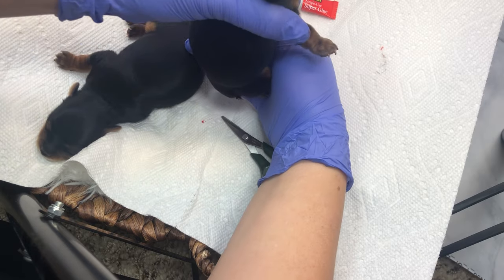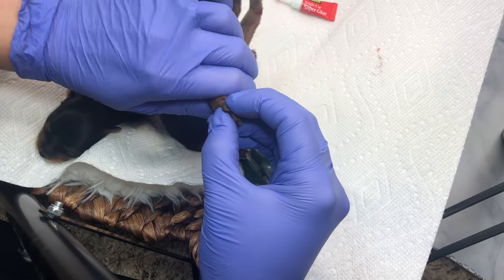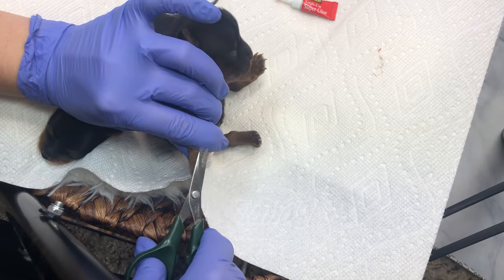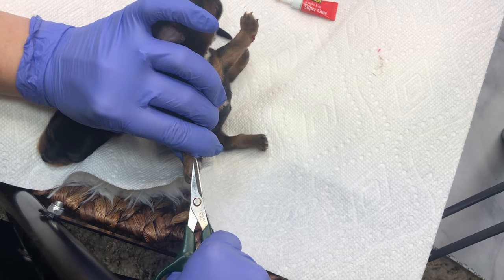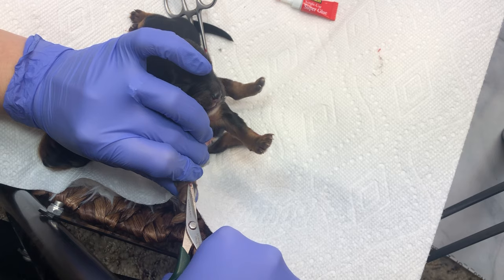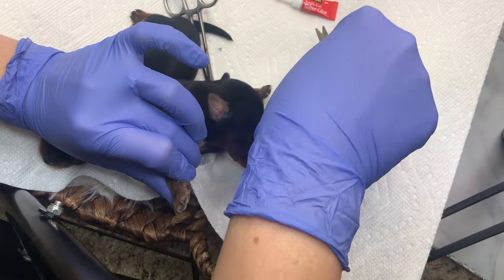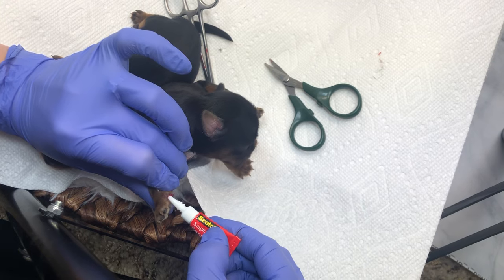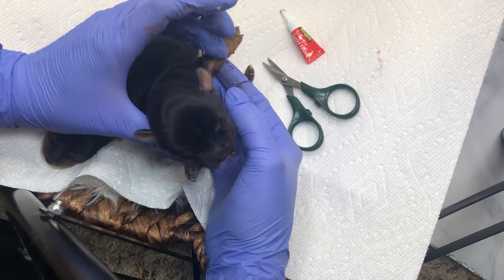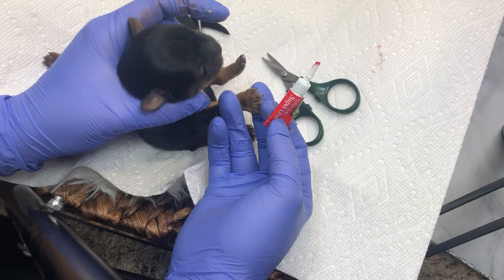For the other side, because I'm right-handed, I try to hold them like this so I can get a hold of that a little better — because you don't want them wiggling. Now we're going to look for that seed. You can see I have to kind of push in — that's the part they don't like, but you've got to get that seed out or it will just grow back. We're going to put a little Super Glue and tap that to make sure it dries.